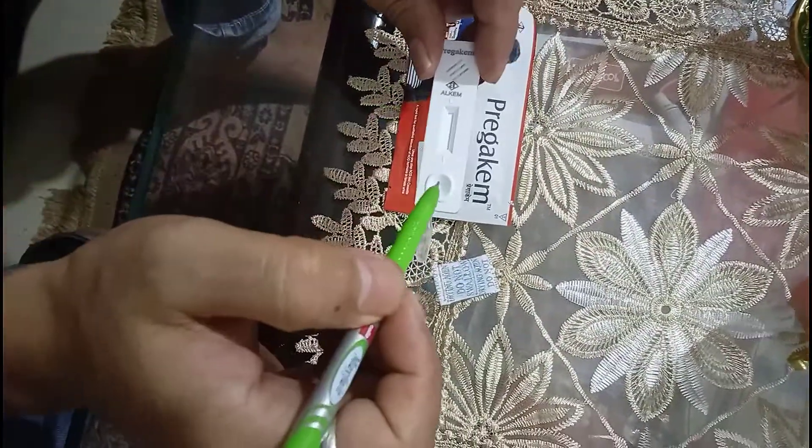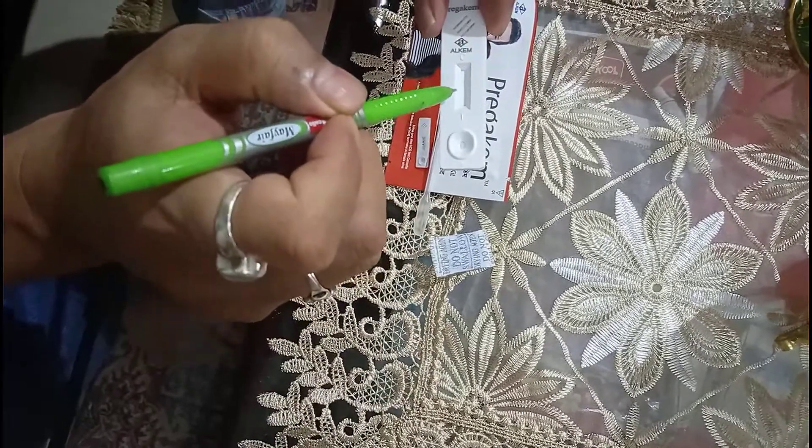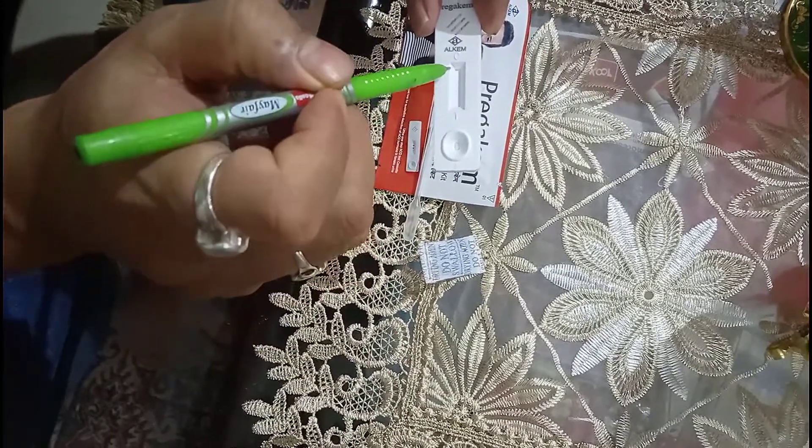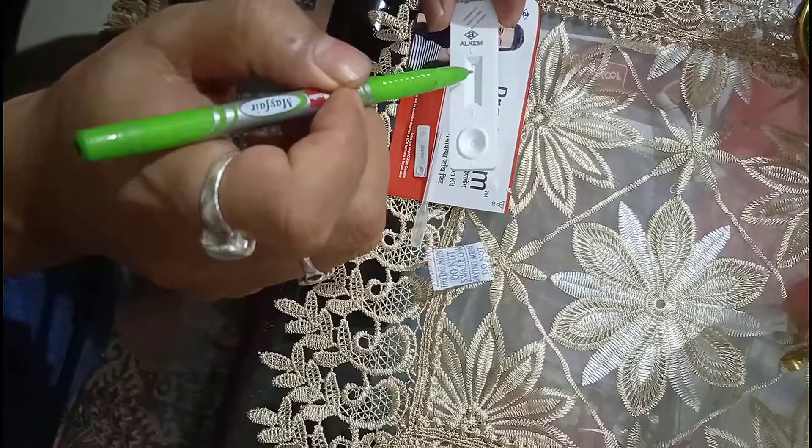We dip the dropper, then put the urine in, and the urine flows up to what is called the test window. There are two lines in the test window called the test line and the control line.